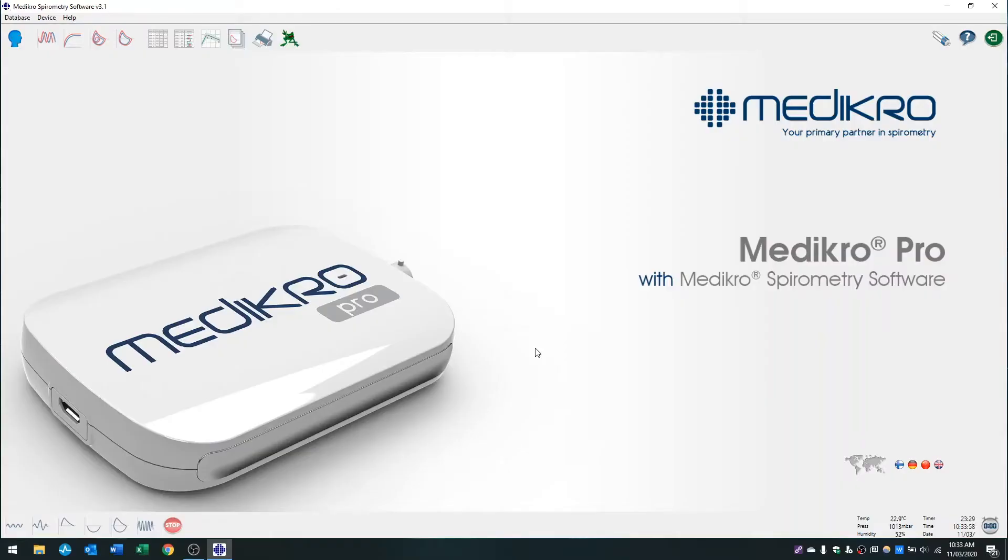Hi, this is a Bird Healthcare video on how to perform a calibration check in the Medikro spirometry software.